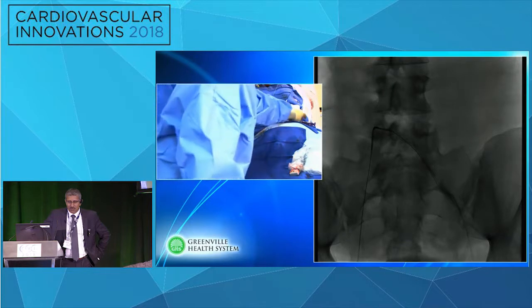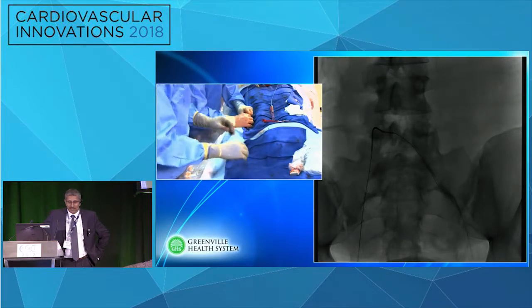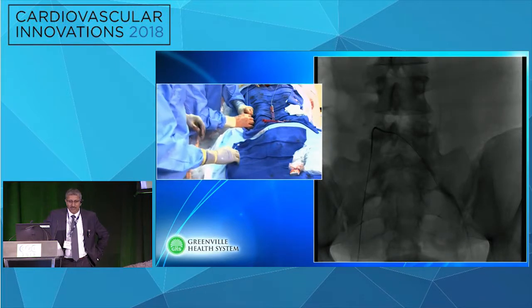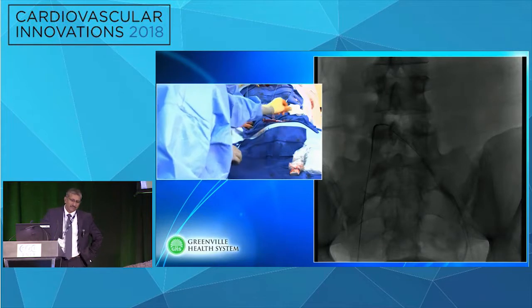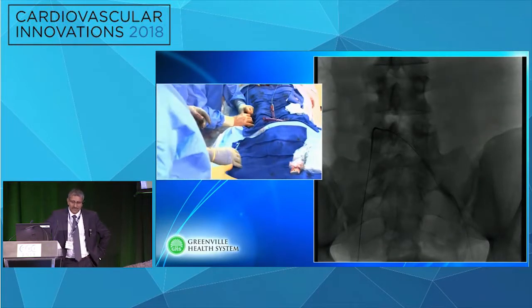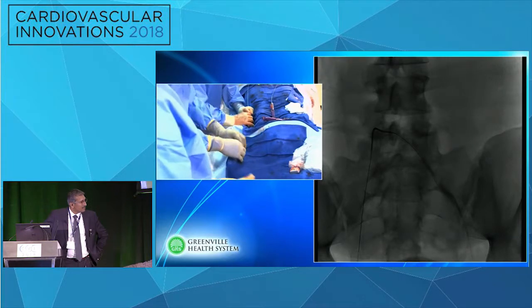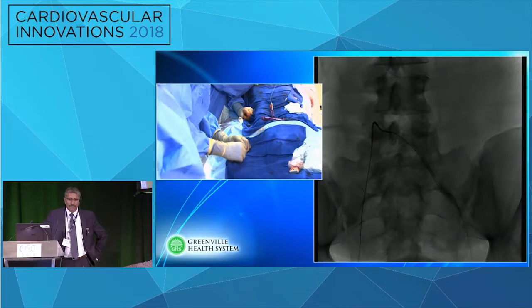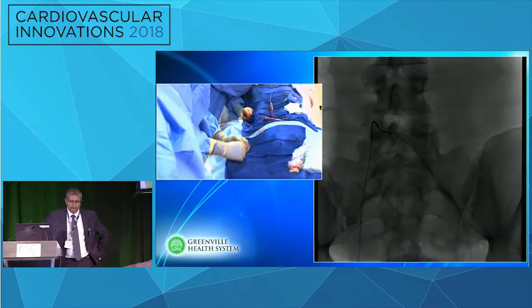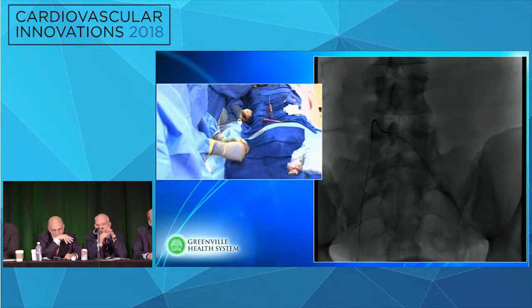That's the trouble spot. Once we get the catheter through, would you consider ballooning the ostium a little bit, just with a low profile balloon? Yeah, we could try that. This is a 2.8? It's a Confianza. Will that wire go? Is this an 018 or 014 wire? Just put another wire through it alongside it. It'll give you the support. Will that wire go just a little bit more?